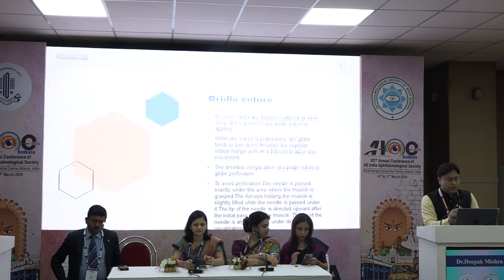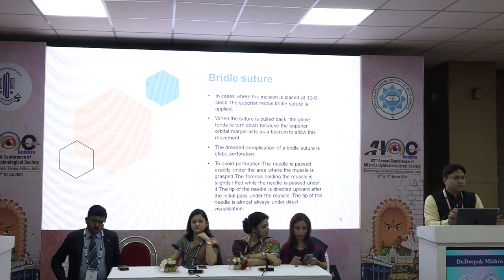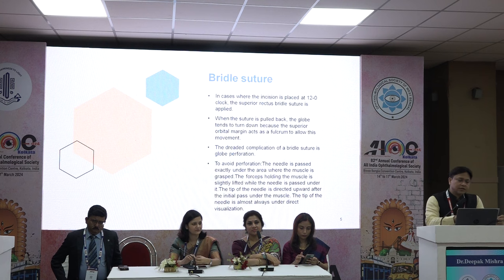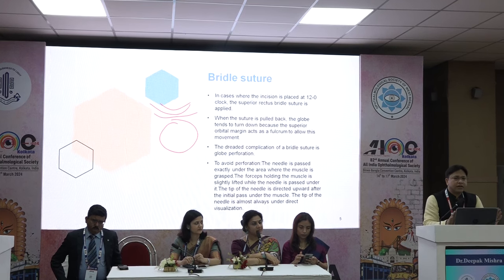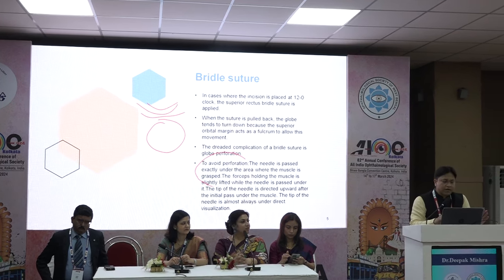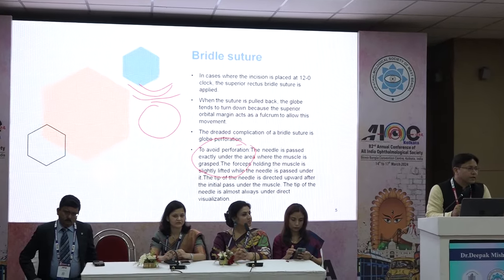Regarding the bridle suture, we all know nowadays there are various markers and globe stabilizers to fix the globe. But if you are using a bridle suture, then take care of it. In the initial days, when you are holding it, it may go partial or incomplete, with conjunctiva involved, but don't be afraid of that. The only real concern is don't go so deep that you perforate something, or don't grasp so tightly that you pull out the superior rectus muscle.